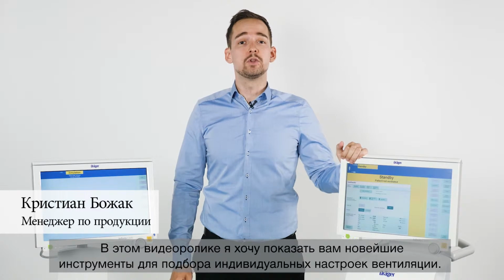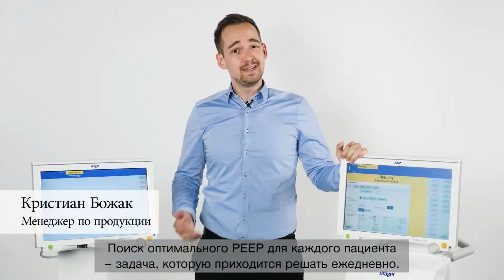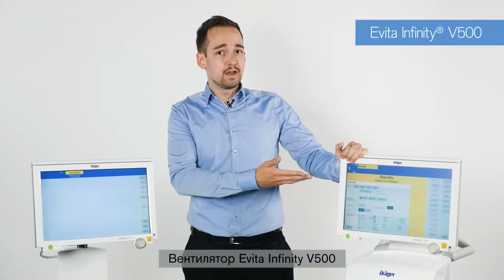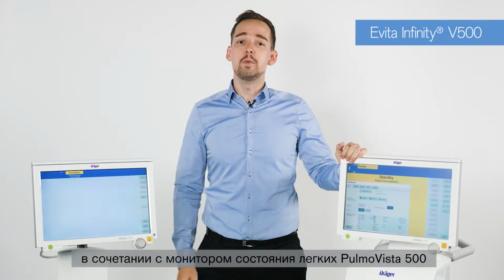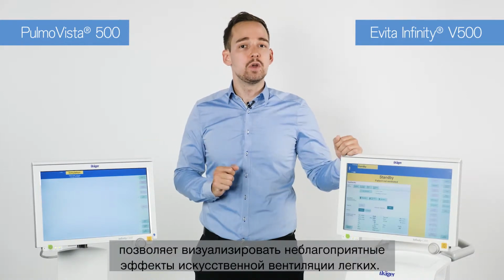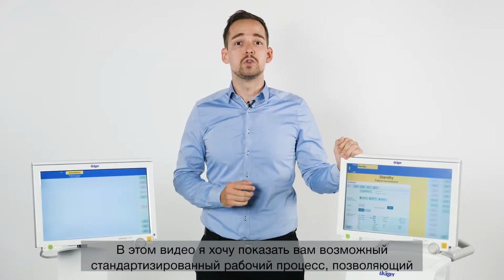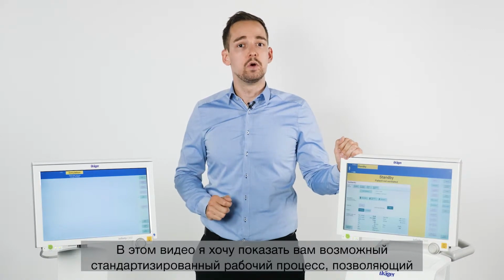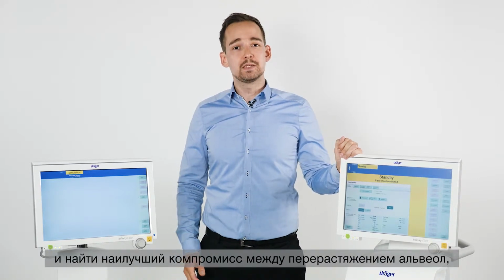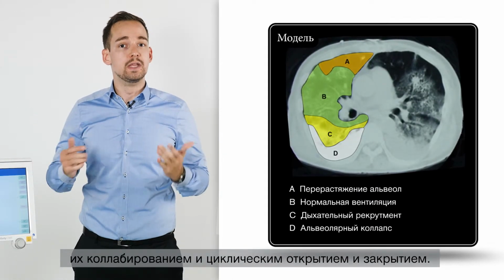Within this tutorial, I want to show you the latest tools for personalized ventilation. Finding the best PEEP for each individual patient is a daily challenge. The Evita V500 ventilator, in combination with the lung function monitor PulmoVista 500, allows to visualize the adverse effects of mechanical ventilation. In the following video, I want to show you a possible standardized workflow to analyze the lungs' response to different pressure levels and to find the best compromise between alveolar overdistension, collapse, and cyclic opening and closing.